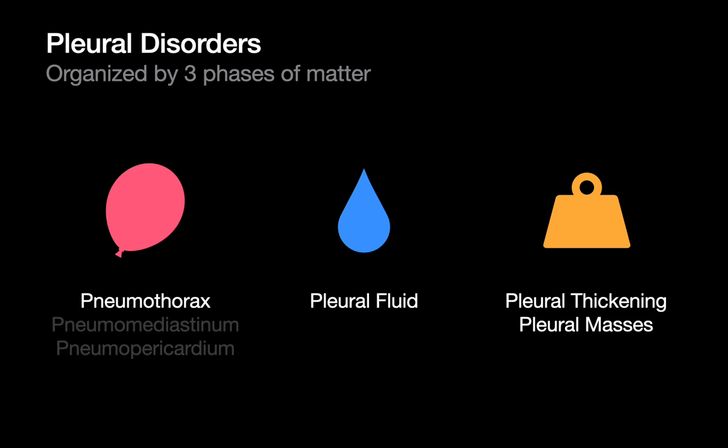With pleural disorders, I find it's nice to break things down according to the three phases of matter: gas, liquid, and solid. In this talk, we're going to first start with pneumothoraces, then move on to pleural effusions, and then finish with pleural thickening and masses. We'll also spend a little time talking about pneumomediastinum and pneumopericardium. Because the diagnoses of pneumothoraces and pleural effusions are relatively trivial on chest CT, we'll be primarily focusing on chest x-ray appearances for the first two portions of this talk.